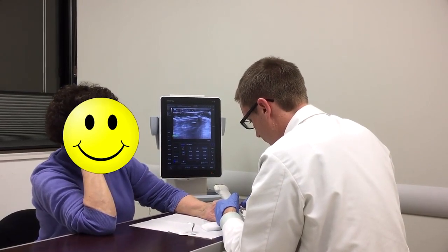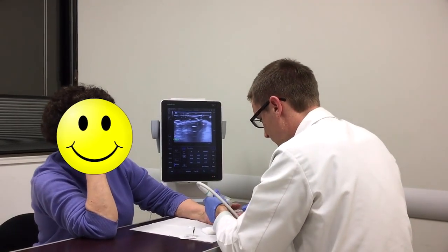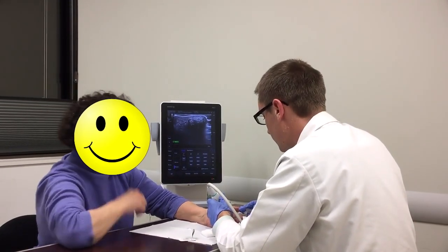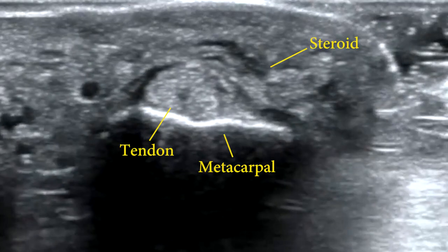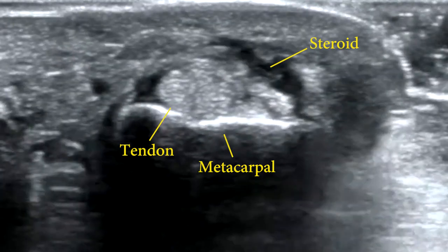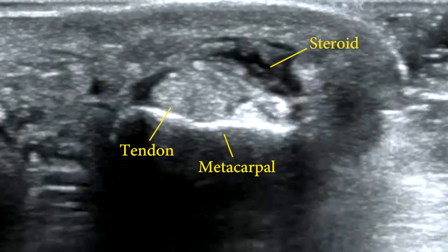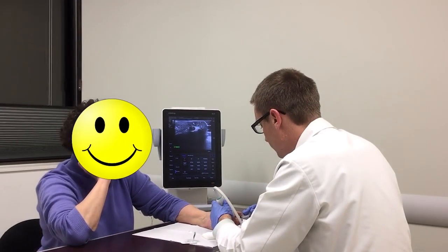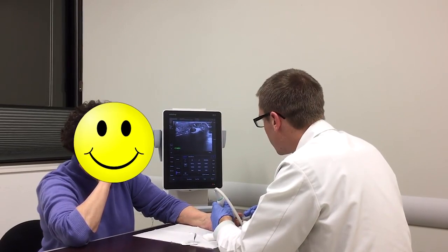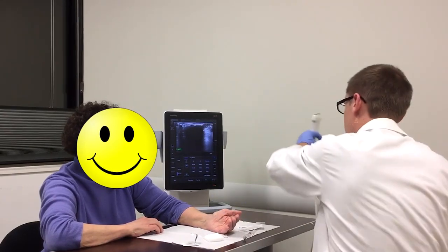After obtaining the ultrasound probe, the needle is inserted at the A1 pulley. The ultrasound has labels for white sonodense metacarpal bone, gray isoechoic flexor tendon, and black anechoic steroid fluid. After the needle is adjusted so that it is superficial to the flexor digitorum superficialis, the dexamethasone and lidocaine are injected. You shouldn't feel any resistance while injecting the steroid fluid.